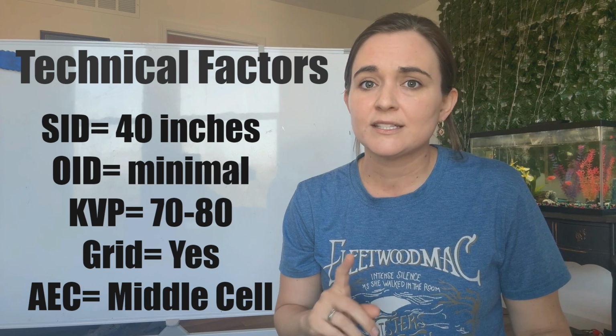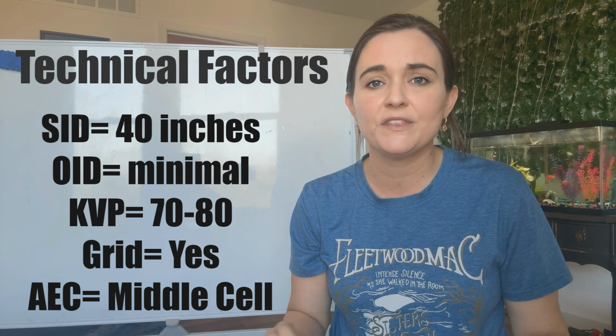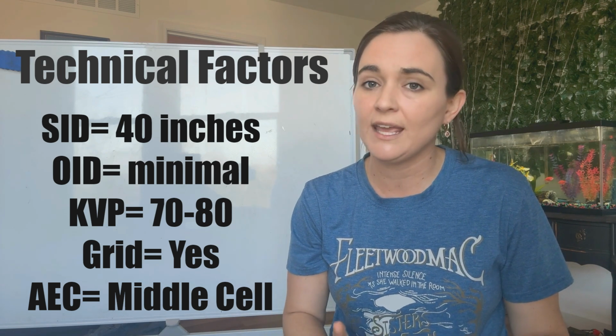Always use a grid. Scatter is everywhere in the abdomen. If you're using AEC, go with the center detector. If not, manual technique works fine. Just adjust for BMI, pathology, and age.